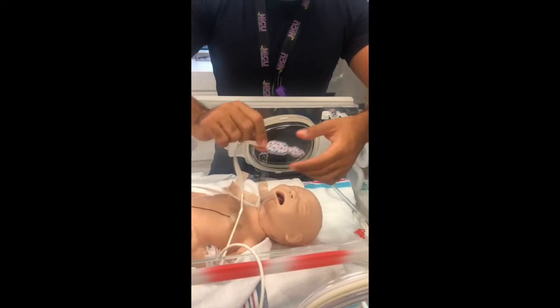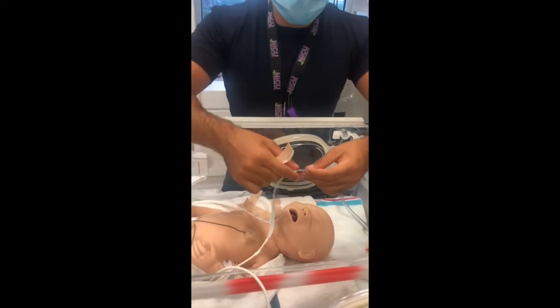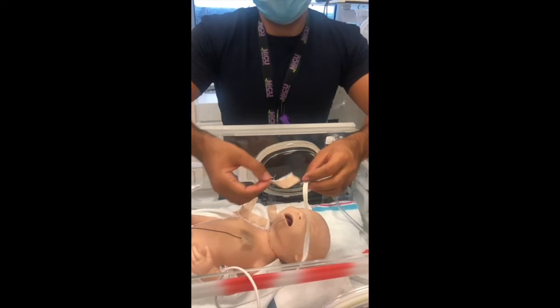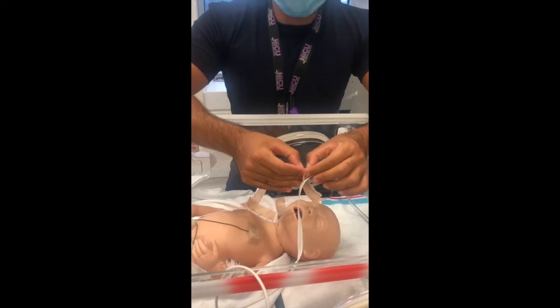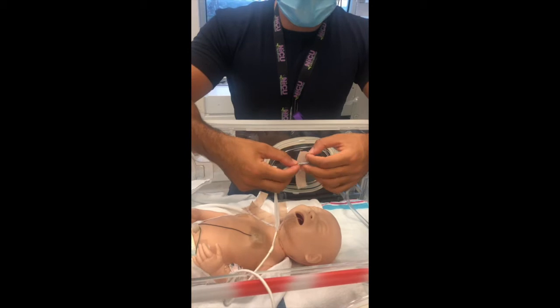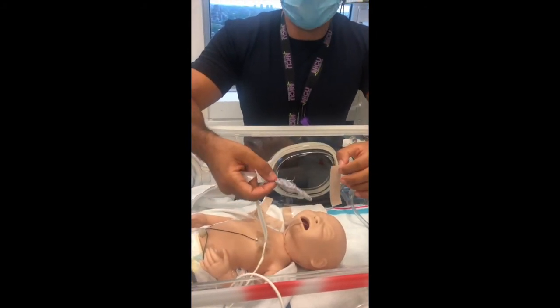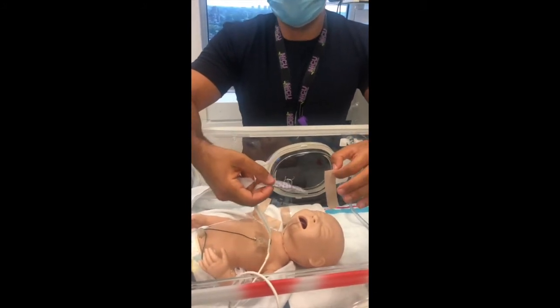We are using sensor number one for cerebral saturation monitoring, which is technically the pre-ductal sensor in some congenital heart defects, but also provides information about regional saturation at the level of the brain. If you have a baby with HIE at risk of seizure, the NIRS might indicate a drop in venous saturation, as there is a lot of oxygen consumption during a seizure event.